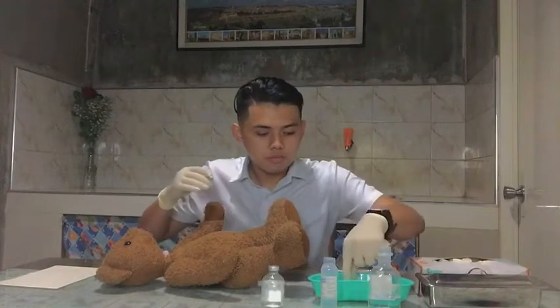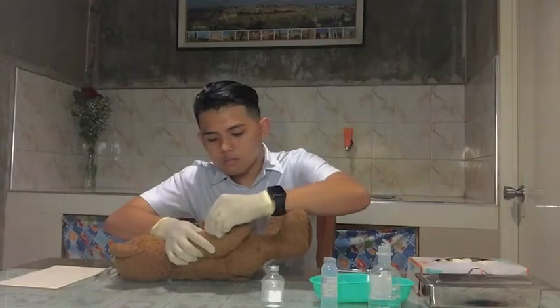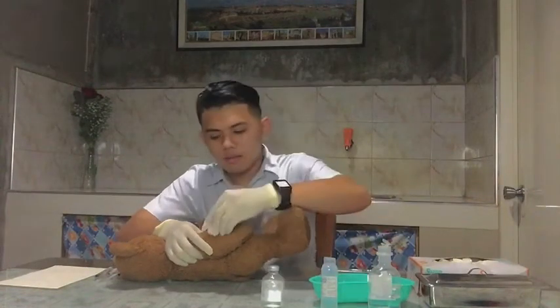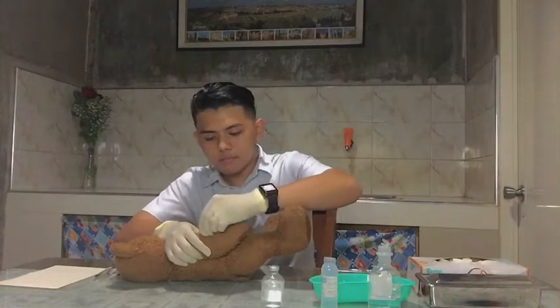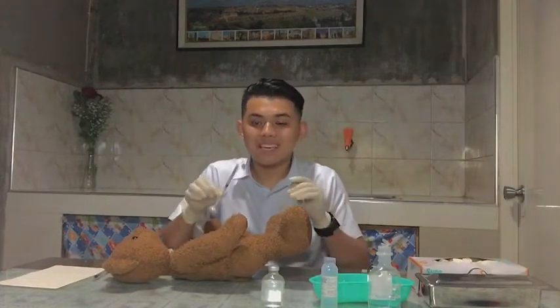So after, we will be cleaning the site using a firm circular motion to prevent entry of microorganisms into the tissue. This is wet, then dry. Now remove the needle cap while waiting for the antiseptic to dry. And drying the skin prevents inactivation of the medication being given.